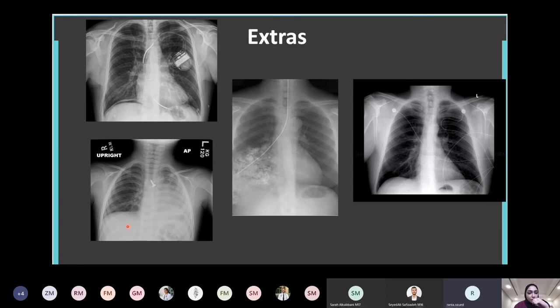If this was a child and he swallowed a Lego piece that is plastic and we can't see it, we're not going to see this, but we're going to see this. So it's a very good picture, this one, to just take a photograph of and keep in the back of your mind, because if it's a child that choked on a foreign body that is not radiopaque, then that's what we're going to see. So the whiteness on the left side is mostly the heart. First identify the heart, and I like how you started with the ABCDs. So if you identify the heart, then that will be the clue.